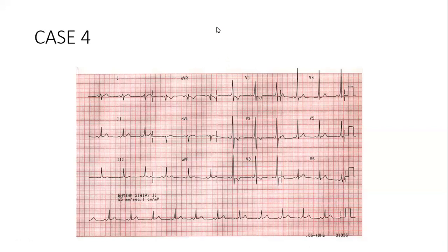And what are your concerns about it? It's a pre-excitation syndrome, Doc. Okay, correct. Let's say you explain to a student, what is a pre-excitation syndrome? What's the problem?